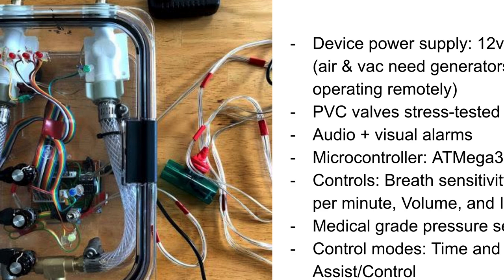The power supply is 12 volts, 1.5 amps. To operate, you need air and vacuum, and may need generators for power if operating remotely. The PVC valves are stress tested at more than 62 hours. There are audio and visual alarms. We use the ATmega 328PU microcontroller. The controls on the machine control breath sensitivity, breaths per minute, volume, and inspiratory-to-expiratory ratio — because it's not an even flow between in and out; they have different ratios. We use a medical grade pressure sensor. There's time mode, which is automatic mode, and assist mode, where it can sense the patient trying to take a breath or exhale and can facilitate that process.